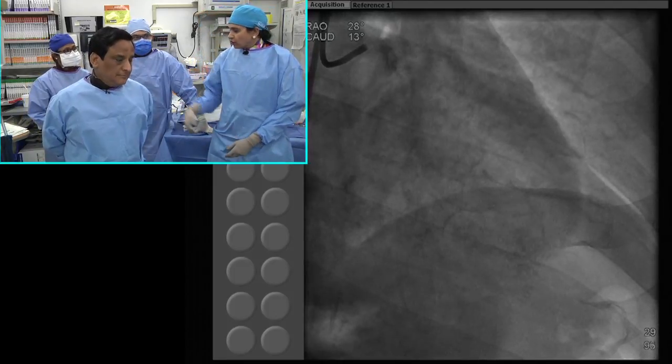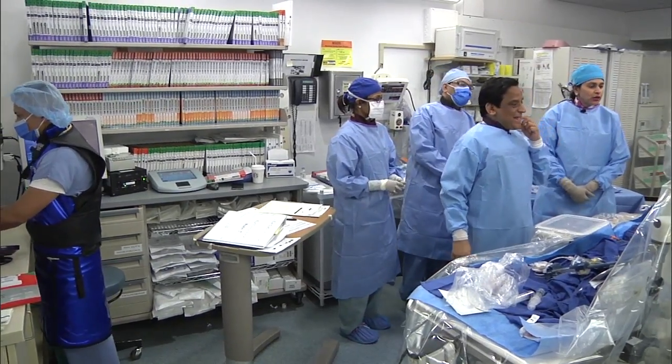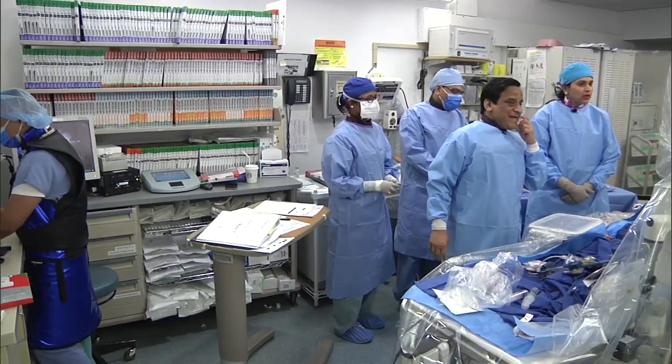Other than that, I think you can focus on our fellows, whom I think you probably asked the question, who are the fellows with you, yes, seeing how smooth it is going, and they are now in their 8th month of their training and all ready to do complex cases. At this stage, they are almost doing most of the complex cases with the attending, myself or Dr. Sharma, besides them doing most parts of these cases by themselves. So that is why you see that they are into that groove and everything is going smooth. They know how our thinking is going, and they are having the devices ready as the case goes on. I wish them well. Anu, great case.